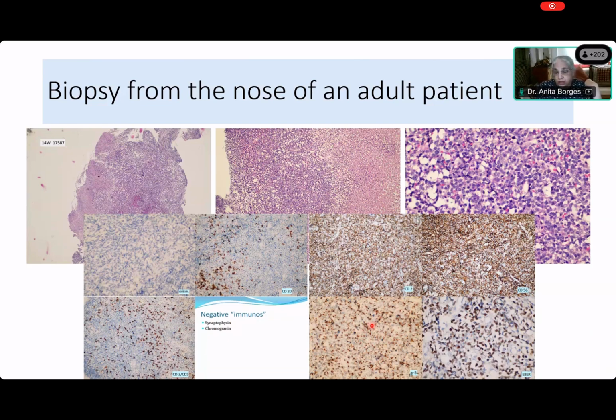Come on, anybody? What are they saying in the chat box? They're saying NK cell lymphoma, NK/T cell lymphoma. It's T and NK, because there's T and there's NK in that, and then it's got Epstein-Barr virus. So what is that tumor that occurs in the nose? It's an EBV-associated non-Hodgkin's lymphoma of nasal NK/T cell type. I don't want you to make a diagnosis, for God's sake. I'm just showing you what we come across, which we call poorly differentiated malignant tumor, and what it gets turned into after immunohistochemistry.